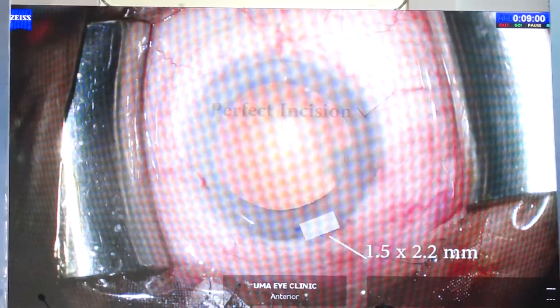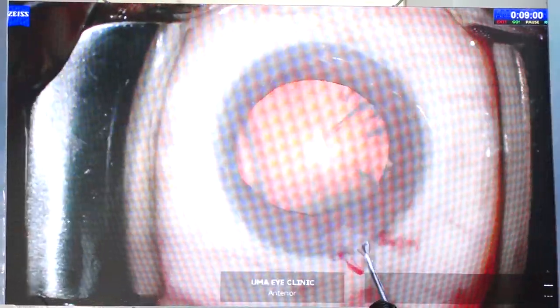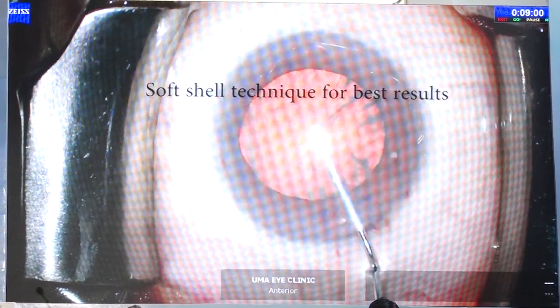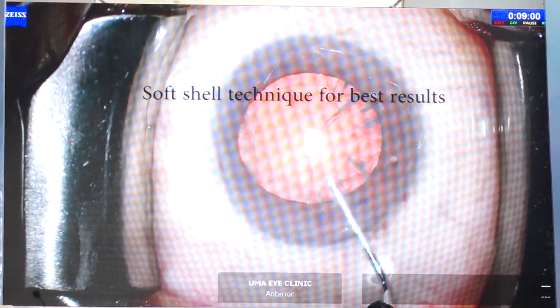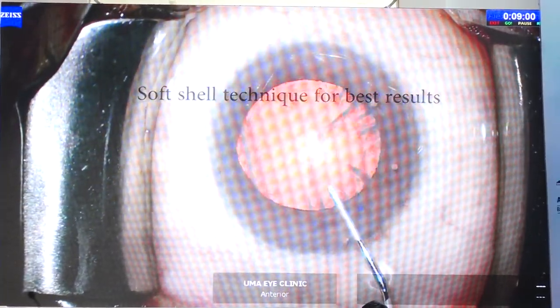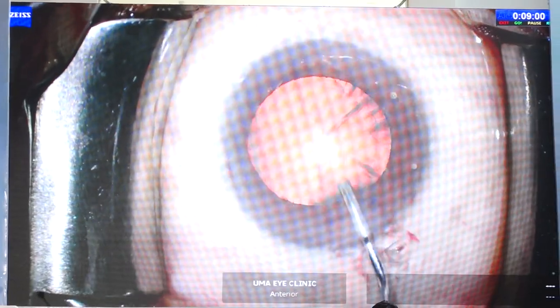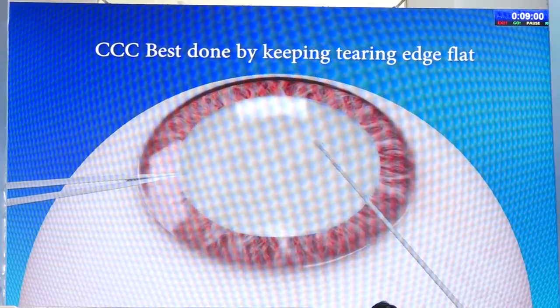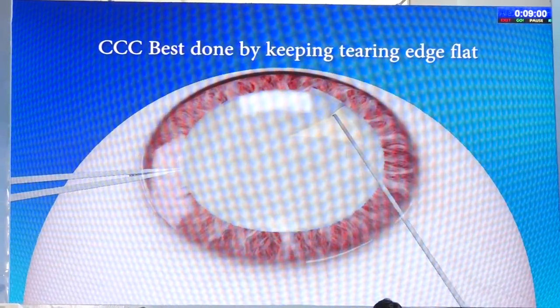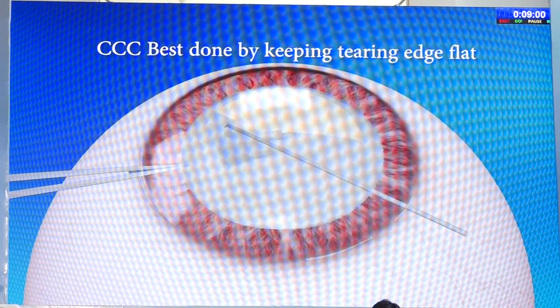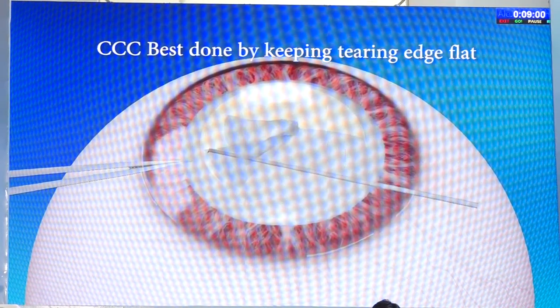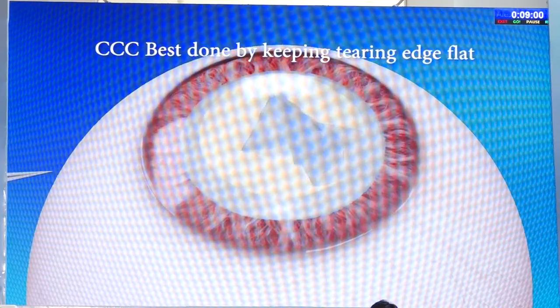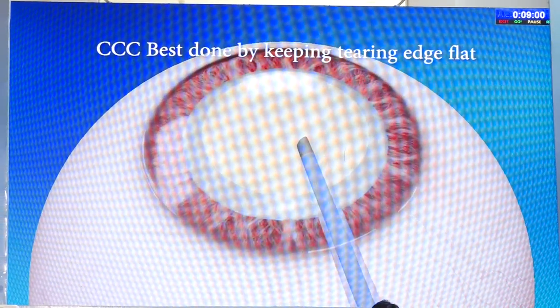For good endothelial support, do the soft-shell technique — put in high-viscosity viscoelastic, and under that put HPMC on the surface of the lens capsule. The best CCC comes if you keep the tearing edge flat — don't let it bunch up. On a slightly dry cornea, take a 5 mm ring marker and mark it. Once you mark it and put HPMC, the marking is still visible for a couple of minutes. Keep the tearing edge flat and follow the mark to make a perfectly sized, perfectly centred rhexis.